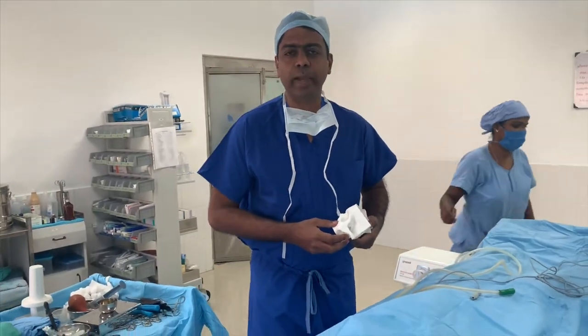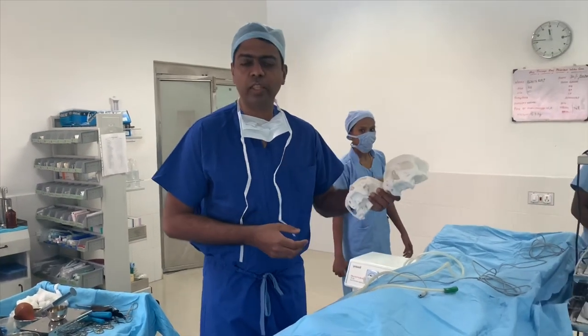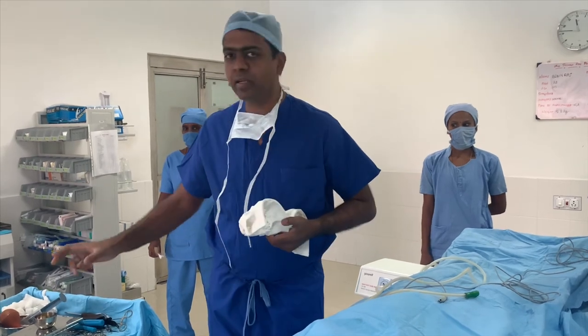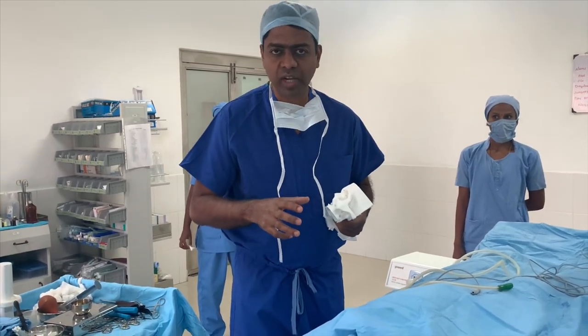I've got stereolithographic models done, so we've got the planning and the implants fabricated. We're about to start this orbital reconstruction case. I've got the stereolithographic models of this patient — this is before, and this is where we need to get to. We've already designed what needs to be done on the computer, taken a printout, designed an implant, fabricated it, and the implant is ready.